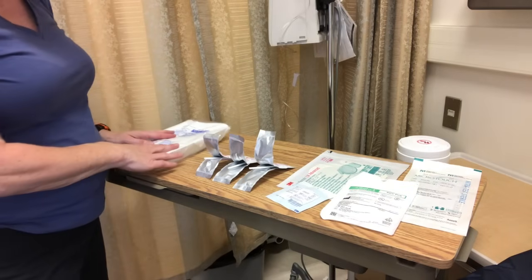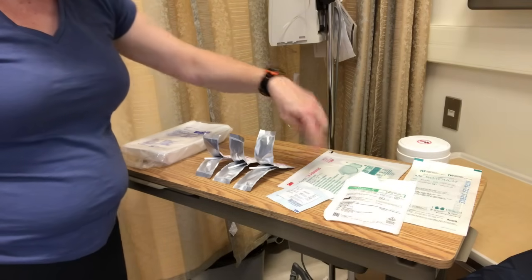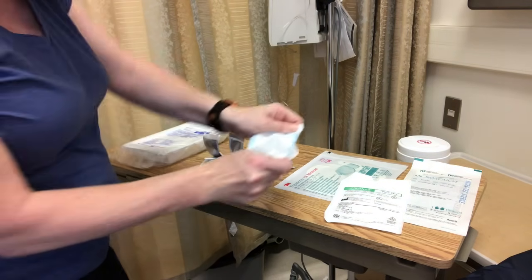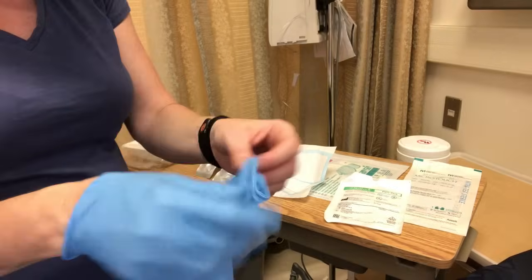If you were to open up your sterile dressing tray at this point, the items you would be putting on it would be your Tegaderm, your STAT lock, and the sterile dressings inside. I'm going to open this in case I need a sterile dressing to help take off. I'm going to put on my clean gloves and then we're going to start to look at this PICC line.